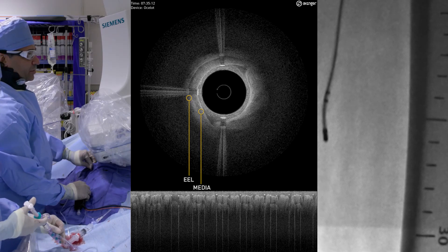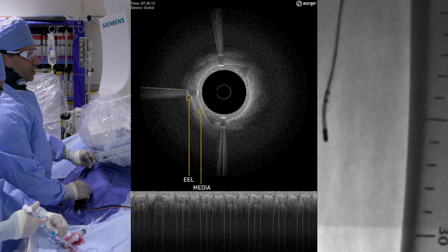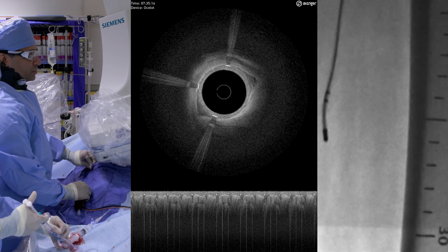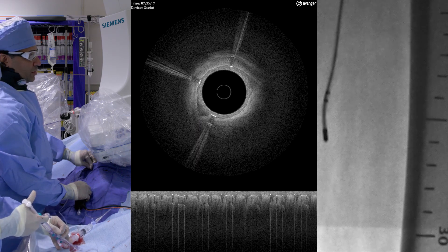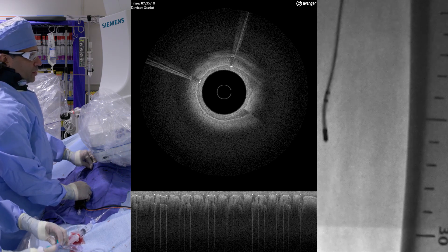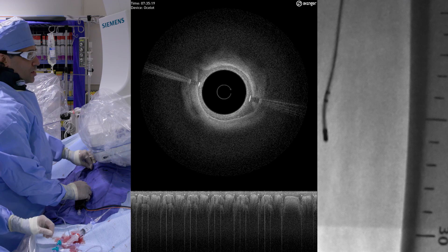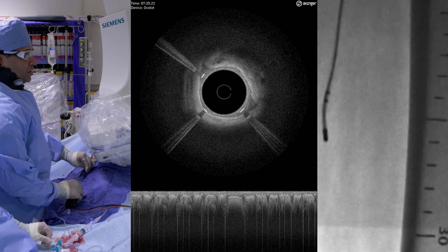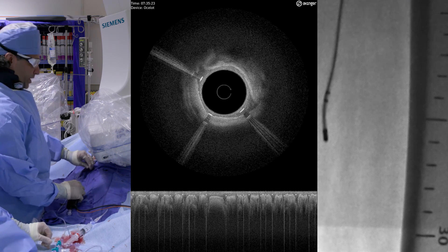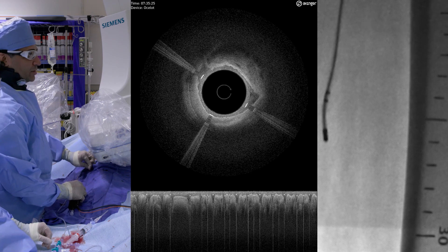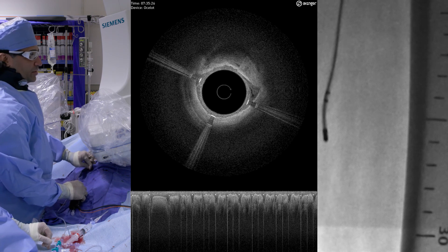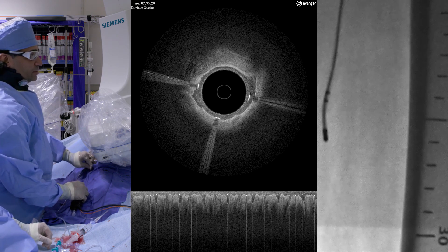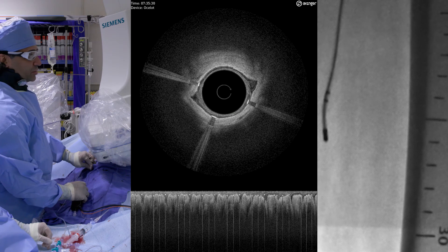Thin cap at 3 or 4 o'clock. Remember, we're doing this with minimal to no fluoro. And even though we have a rad pad, I have a skull cap, I have lead on — still getting fluoro exposure.